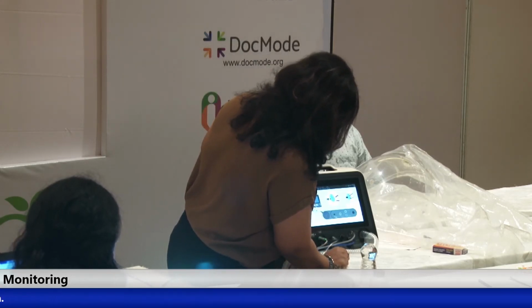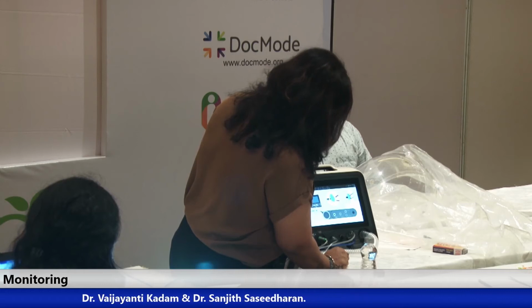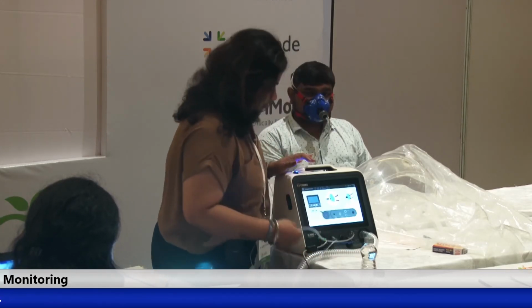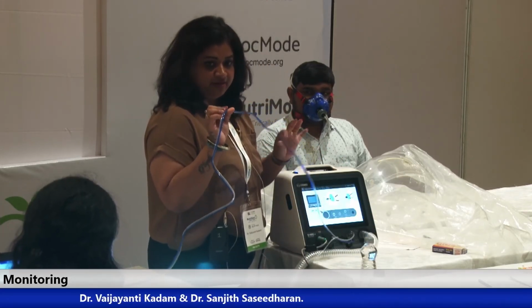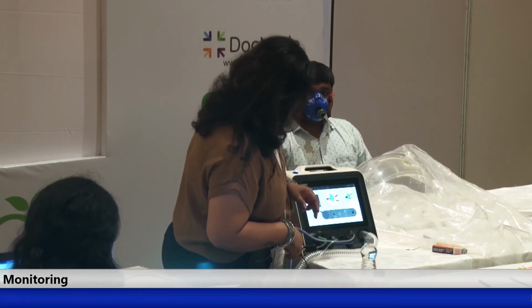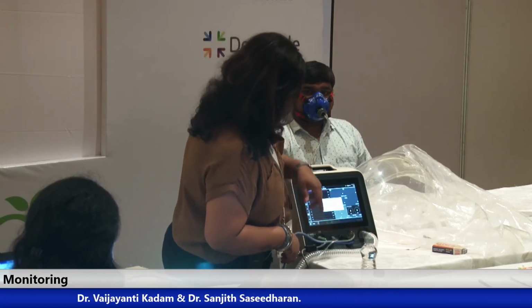It will take 2-3 minutes for the calibration, and then it will just start off. So these wires are the gas sampling wires. From these, your gases are getting measured inside this. Okay, so it has started now. It's calibrated already. Now it will say start. Okay, so I start, and it will start.